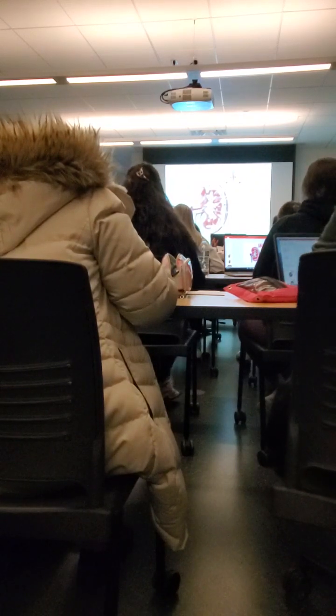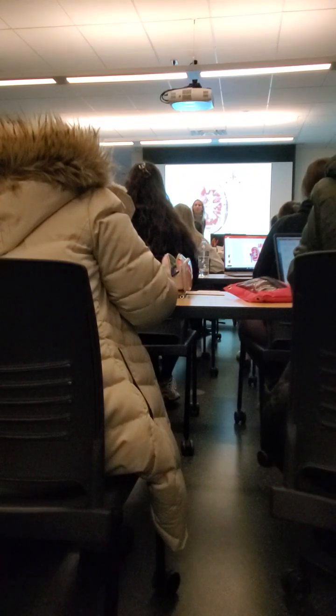So these are the fingers of the glove. And then from the calyces, we have that major pelvis portion, and then that's going to empty out into the ureter. What's more anatomically correct? The bands of cortical tissue, the columns of Bertin. They're just structurally there.